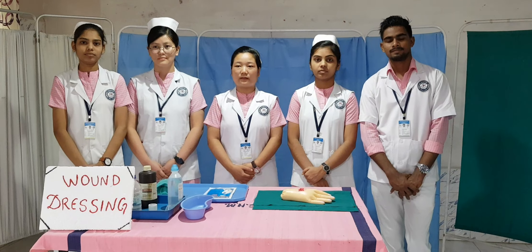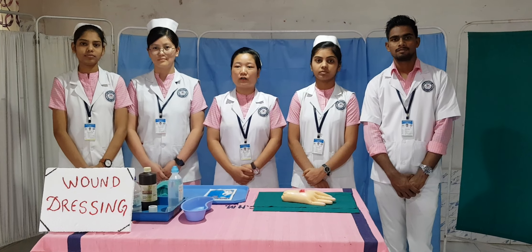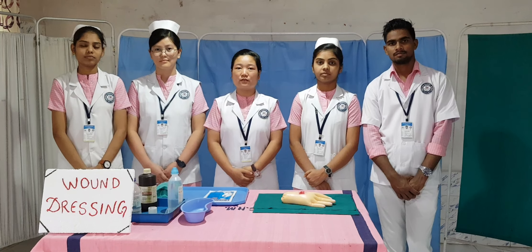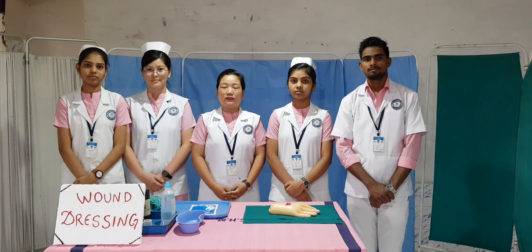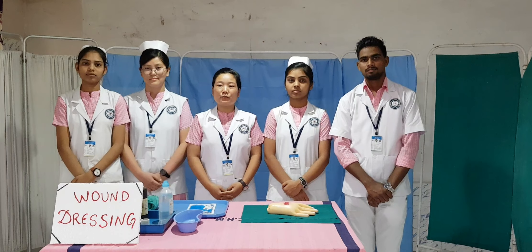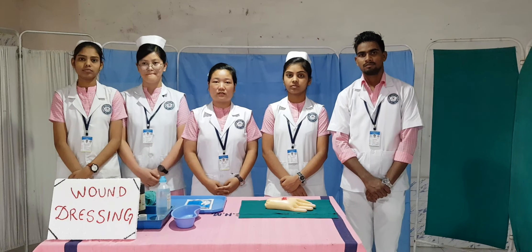Definition of a wound dressing: a wound dressing is a direct patch or compress applied to a wound to promote healing and to protect the wound. The reason we have made this simulation is to improve our clinical skills and to be comfortable and confident with the patient.